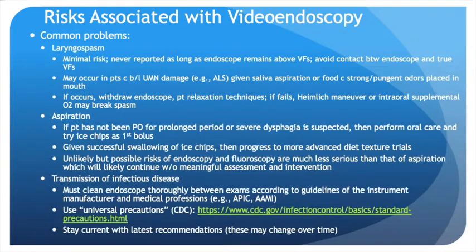It is important to note that risks associated with FEES are unlikely, and the risks are much less serious than that of chronic aspiration, which will likely continue without meaningful assessment and intervention of the dysphagia. With FEES, there is a risk of transmission of infectious disease, and therefore you must clean the endoscope thoroughly between exams, according to the guidelines of the instrument manufacturer and professional medical associations, and use universal precautions. And it's good to stay current with the latest recommendations as these may change over time.